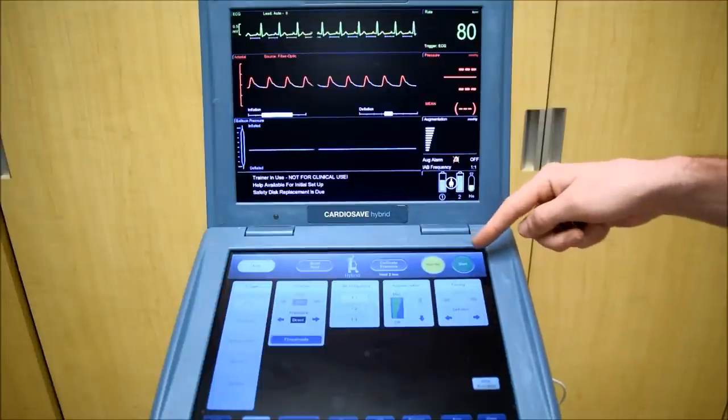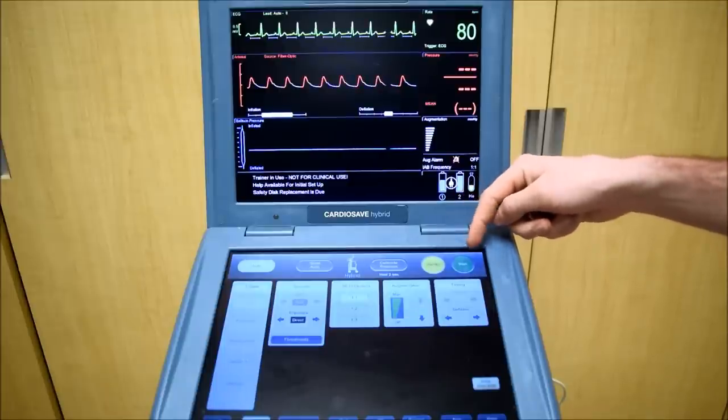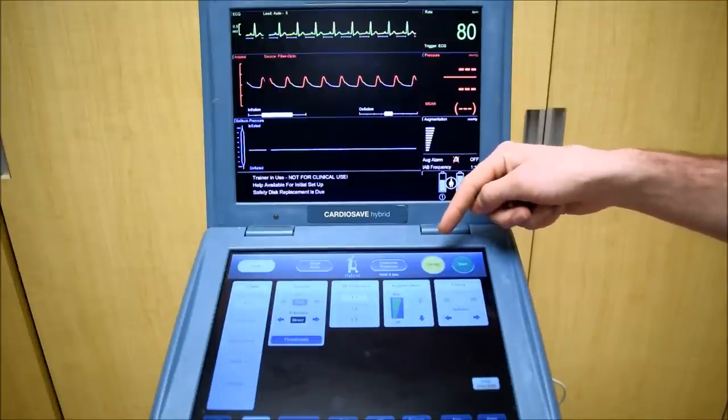You can start the balloon by pressing this button here, and stand by to pause it.